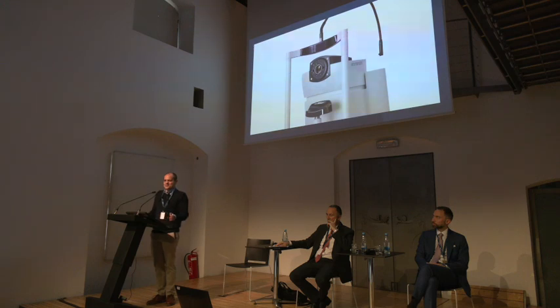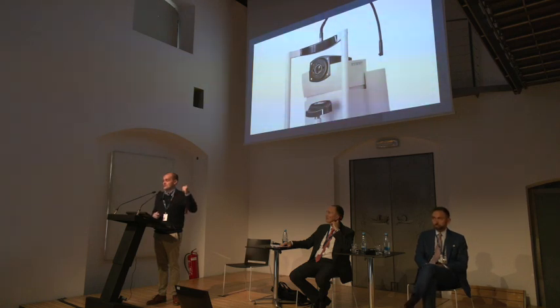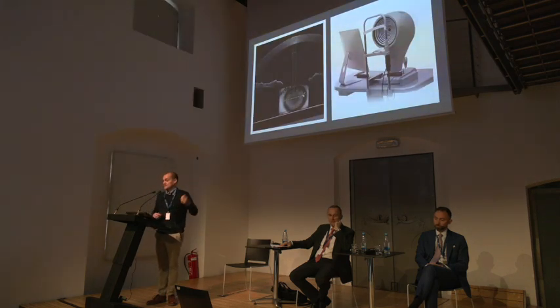I mean, it sounds a little bit strange. 64 slices? Yeah, because there's time. The 64 slices, they take time. And for IOL calculations, a mistake in K values is going to be a big problem. So even the mighty Heidelberg needs something like instant keratometry. Okay. And then we have this.